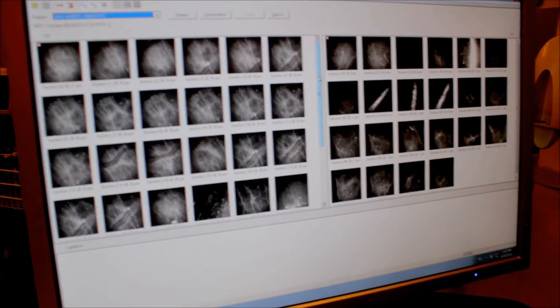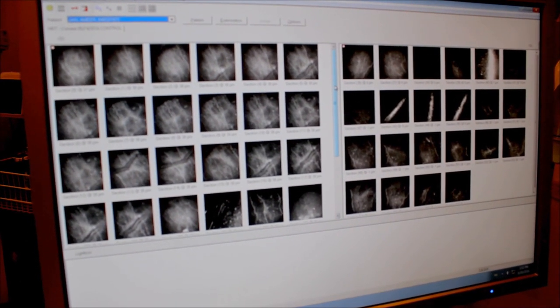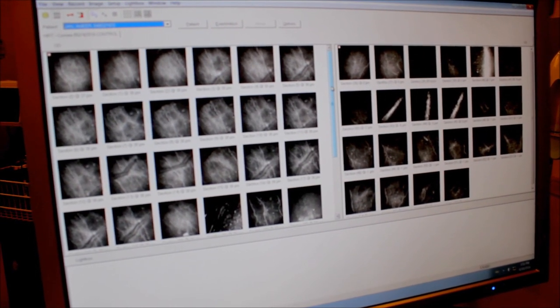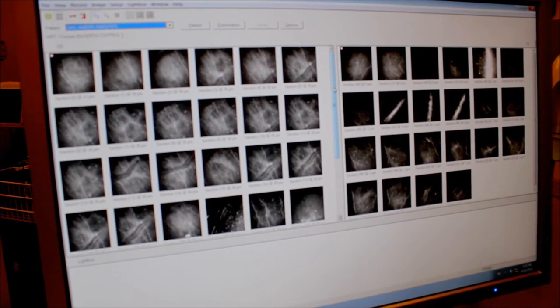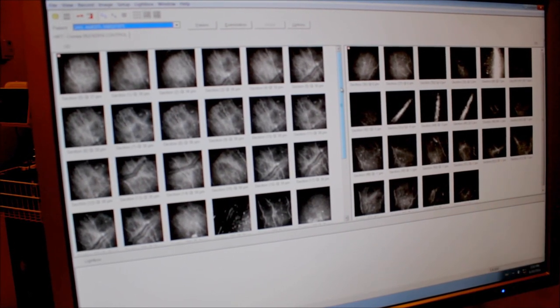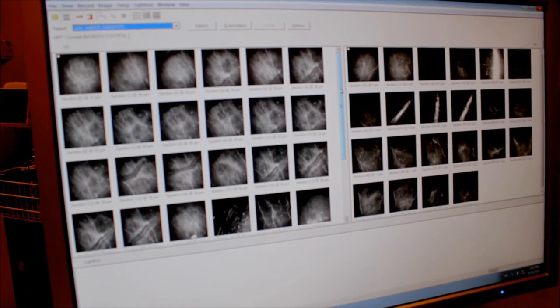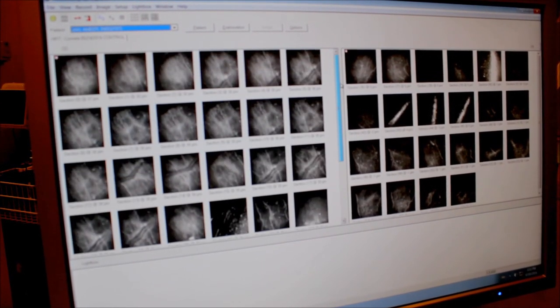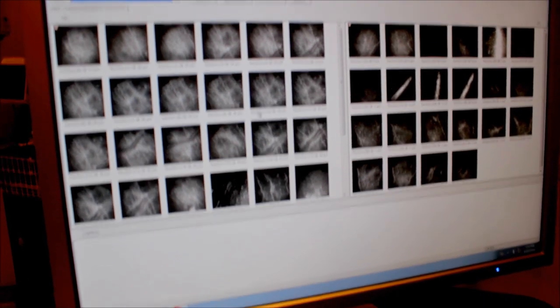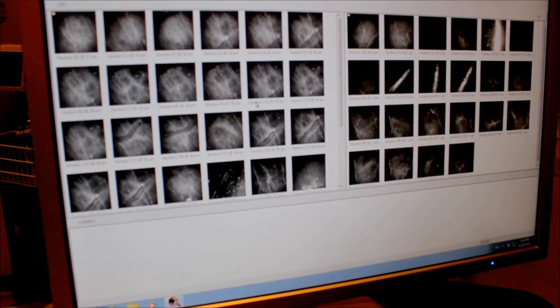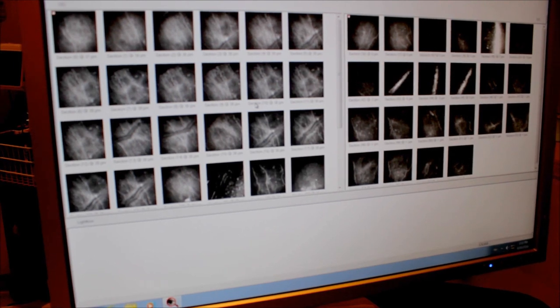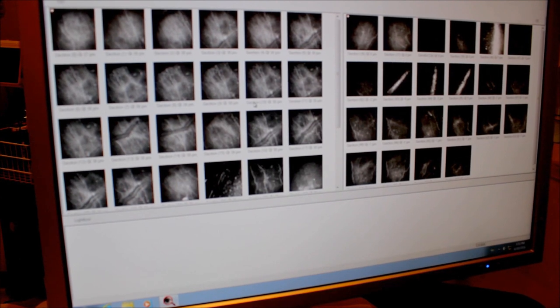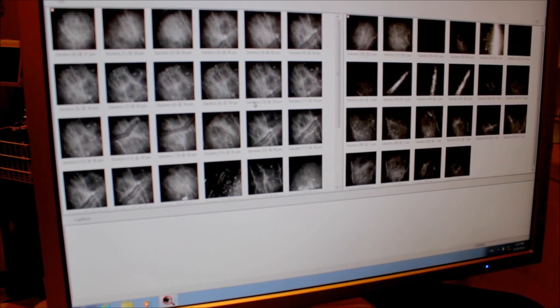This one is a control case — a patient without a reason for neuropathy — which I would like to show you the difference compared to the patient with neuropathy and walk you through exporting images for a control. A quick browse through the patient images. You will notice here that the nerve density doesn't change that much between images. A slight change should be expected and it's normal, but it's not like in the case of the patient we described before.